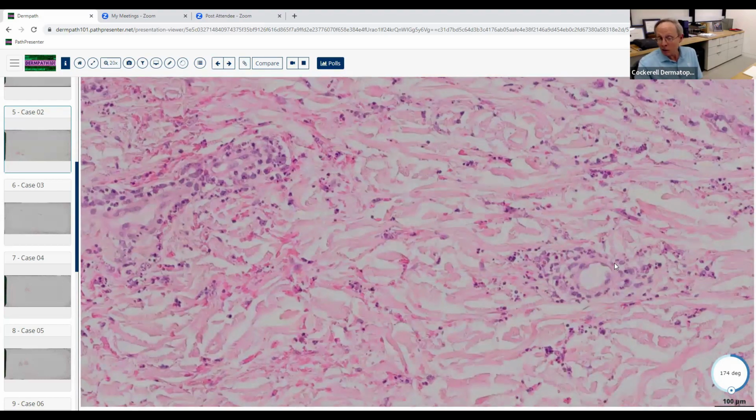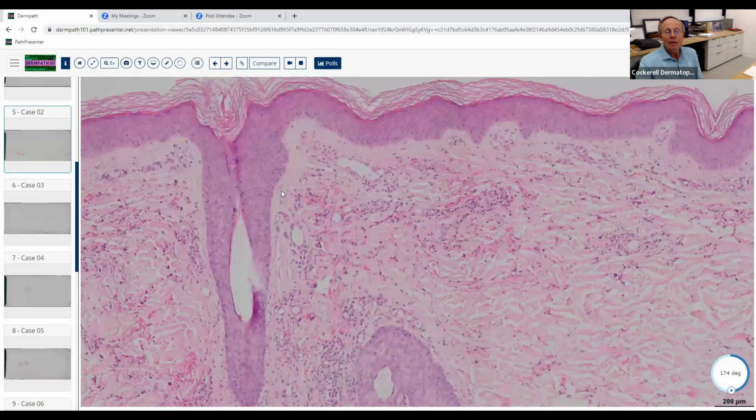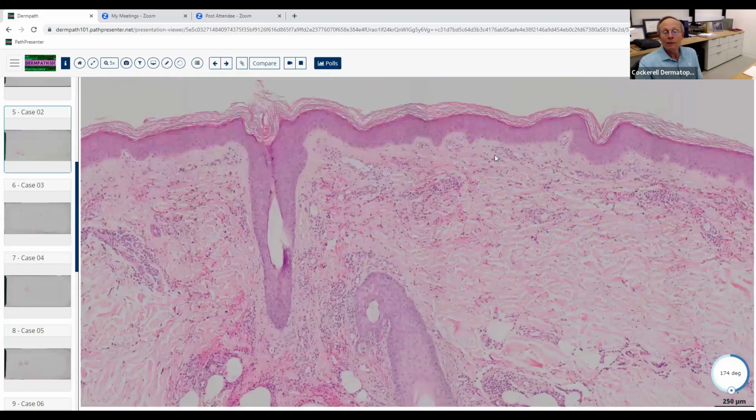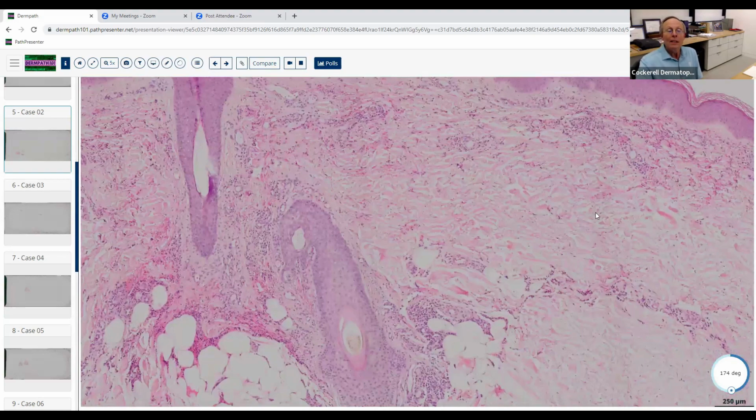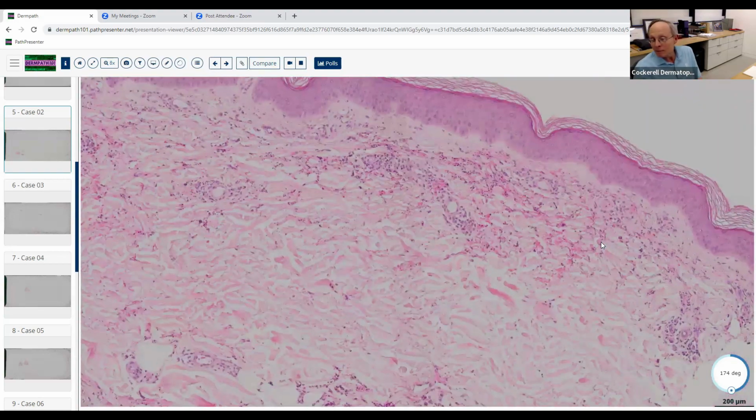If you did immunofluorescence on this, it might be positive. You might see IgA, you might see complement, you might see fibrin in the blood vessel walls, you can see IgG or IgM. We don't know what we're going to see. And the other thing is that we sign this out, and then we get a call from an internist, and they say, "Well, what's the cause of it?" And if the immunofluorescence doesn't show IgA, maybe it's negative, because in a lot of these cases, even though it really and truly is vasculitis, the immunofluorescence is still negative.